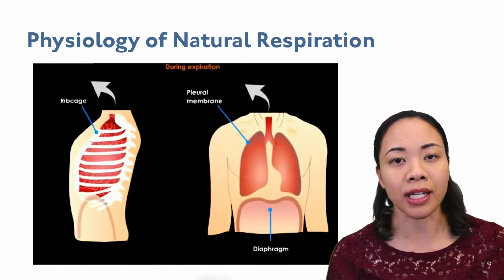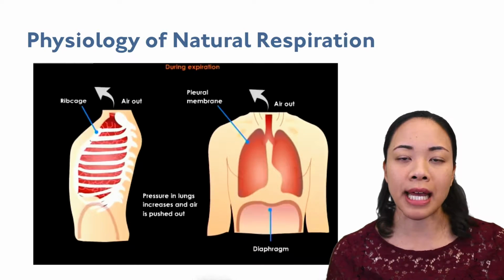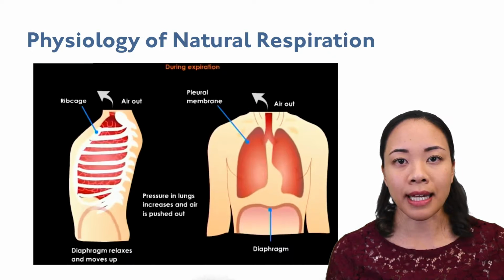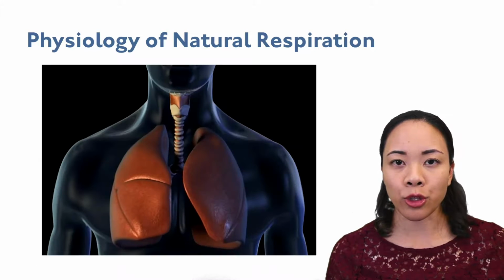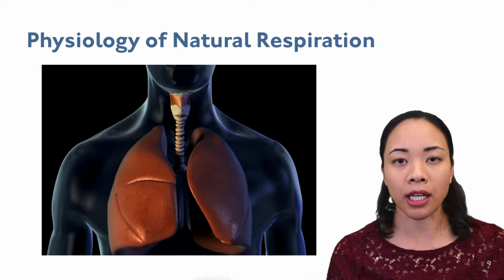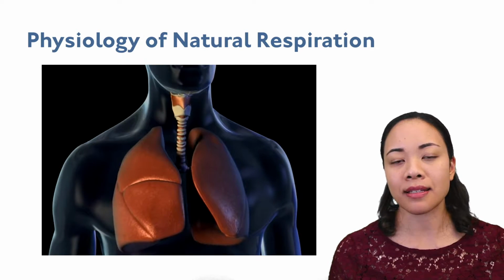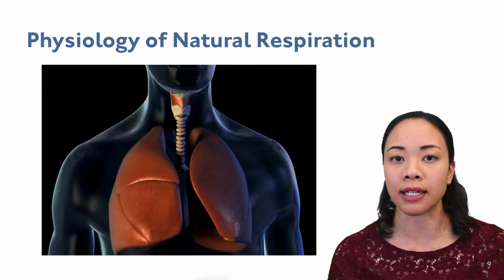During exhalation, the diaphragm and intercostal muscles relax, and exhalation occurs as the chest returns to its pre-inspiratory volume, pushing air out. During cardiopulmonary illness, exhalation becomes more active. Accessory muscles of exhalation are utilized to force gas out and thereby increasing minute ventilation and energy consumption. This is why various negative pressure ventilators were tested in the past. They saw how negative pressure breathing facilitates normal functions of the lung.